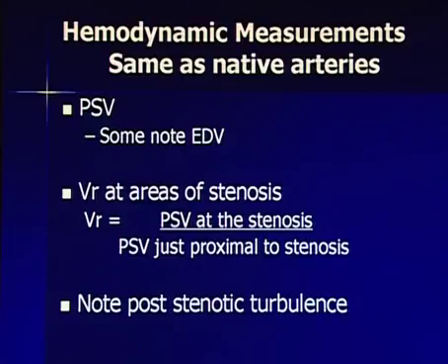As I said, color can be our clue that something's going on. In this example, we see good color filling here, nice, red, coming along, and all of a sudden it changes. Well, it doesn't just change. Something has to make it change, and it's probably a stenosis. We can see the classic aliasing, again, going on in this vessel, where we have the dark red coming up to the orange, to the yellows, to the white, basically crossing over that color spectrum into the blue range. That's consistent color aliasing.